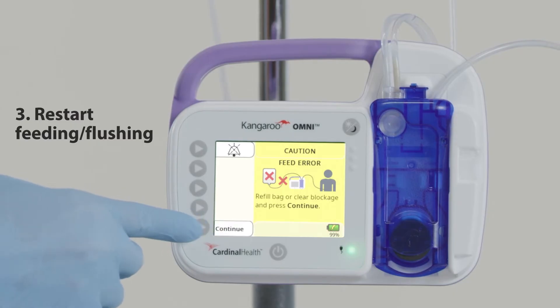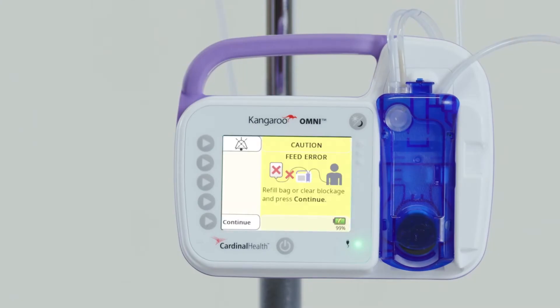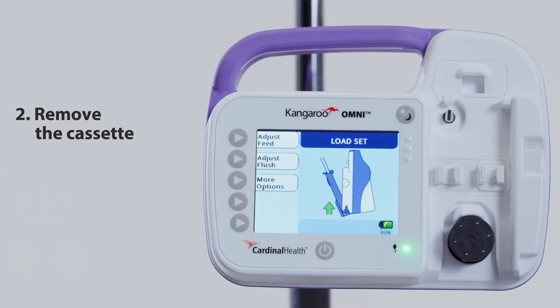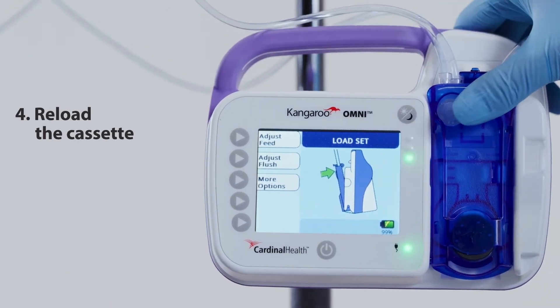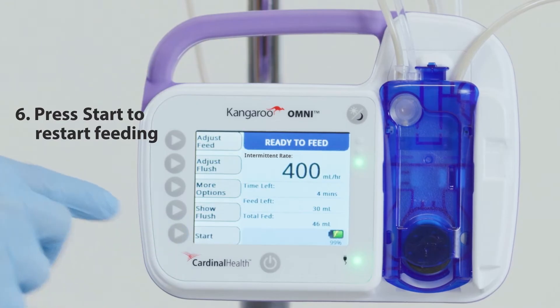Then restart feeding or flushing. If the alarm continues, first ensure the pump is unplugged from an electrical outlet. Second, remove the cassette. Third, clean and dry the occlusion sensor region. Fourth, reload the cassette. Fifth, press skip prime. Sixth, press start to restart feeding.